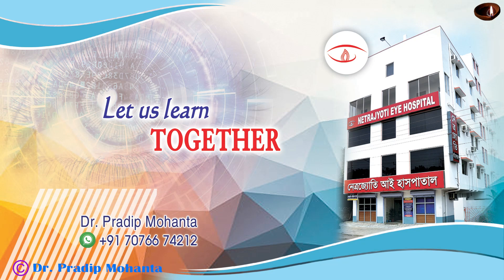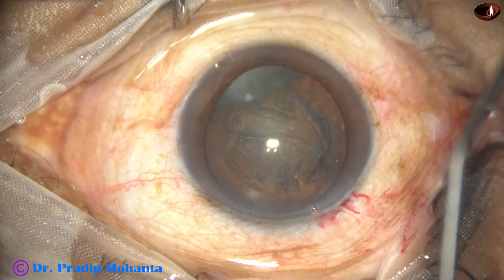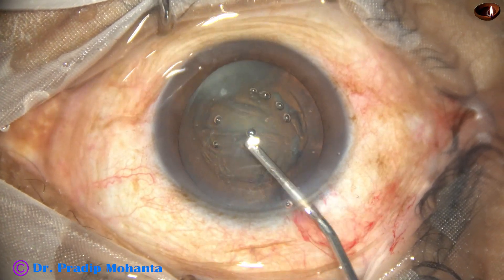Mohanta's pre-chopper. Let us learn how to use this instrument in cataract surgery through these three video clips.